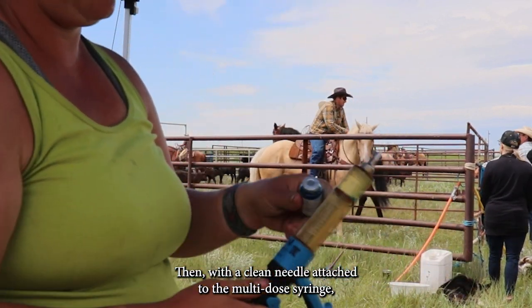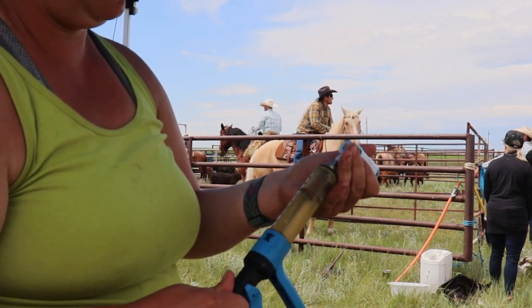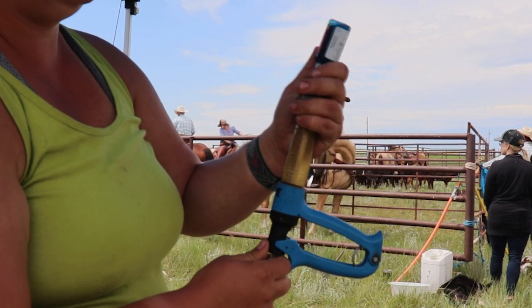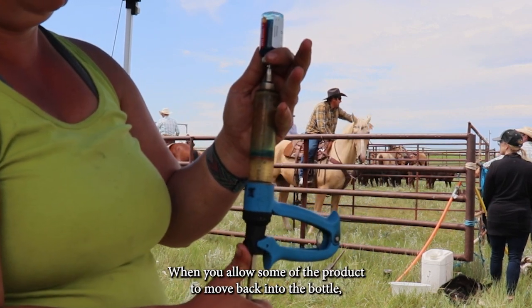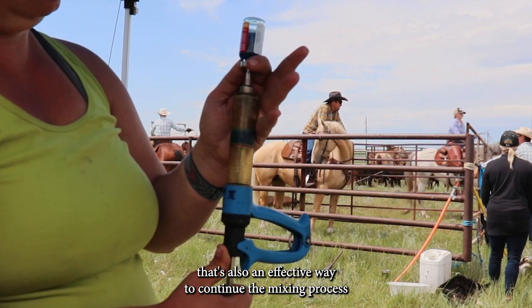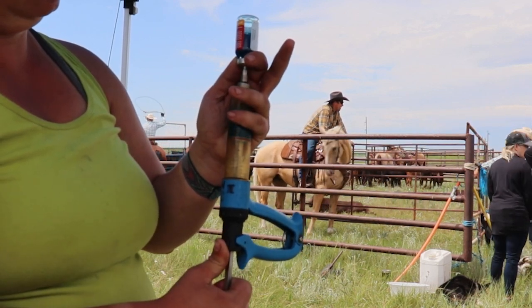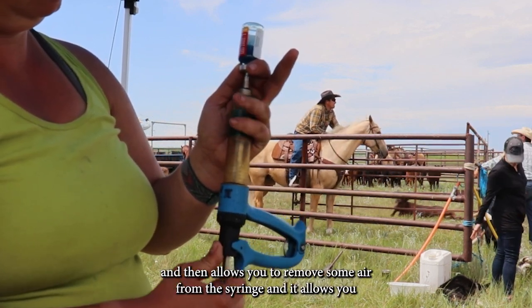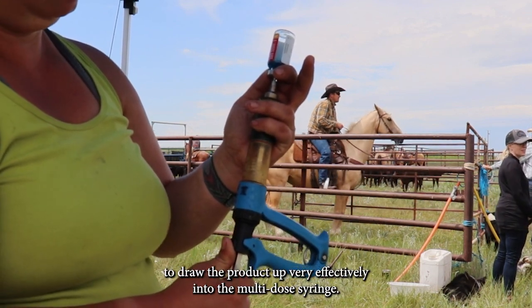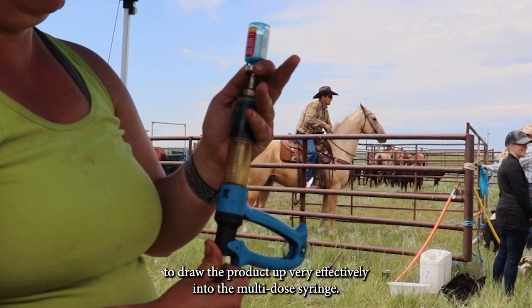Then with a clean needle attached to the multi-dose syringe, withdraw the mixed product out of the bottle. When you allow some of the product to move back into the bottle, that's also an effective way to continue the mixing process. It also allows you to remove some air from the syringe and draw the product up very effectively into the multi-dose syringe.